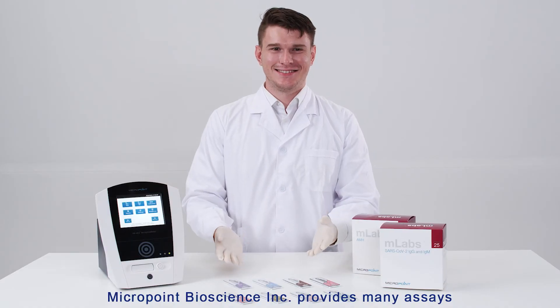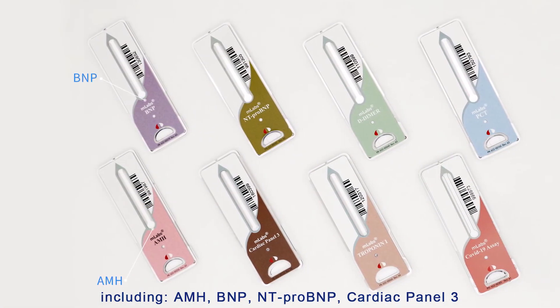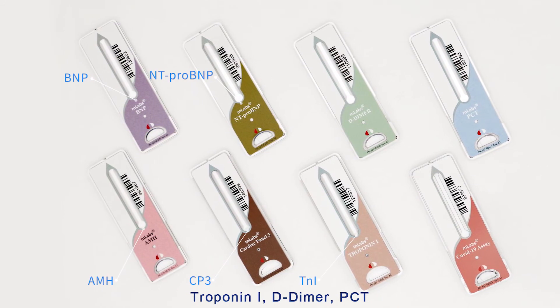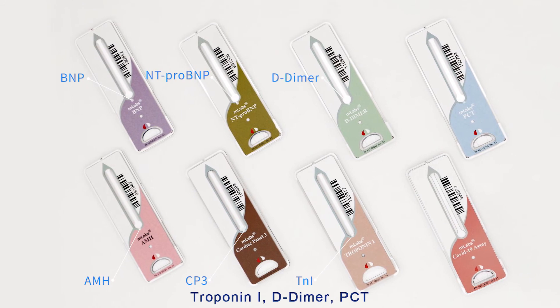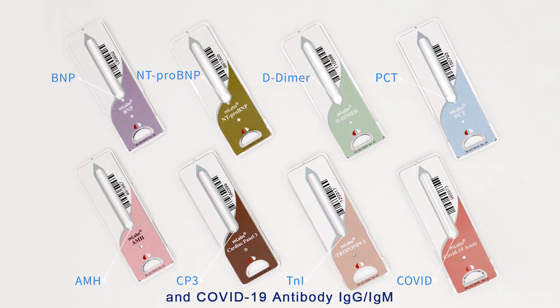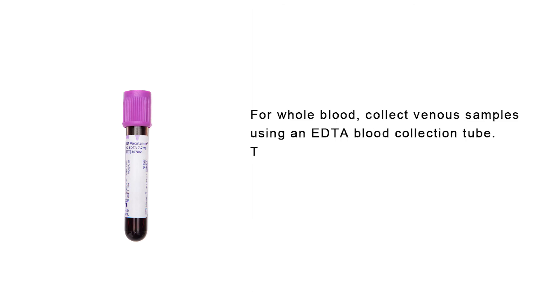MicroPoint Bioscience Incorporated provides many assays including AMH, BNP, NT-proBNP, Cardiac Panel 3, Troponin I, D-Dimer, PCT, and COVID-19 Antibody IgG and IgM. All these test cartridges should be tested with the specific sample type as shown. For whole blood, collect the venous sample using an EDTA blood collection tube and thoroughly mix the sample by gentle inversion of the tube two to three times.